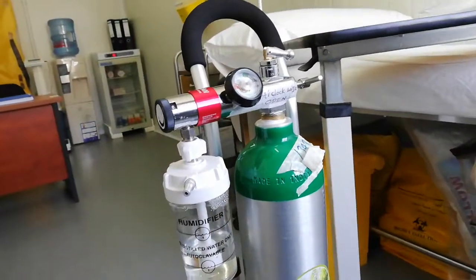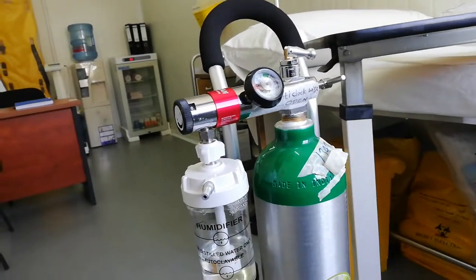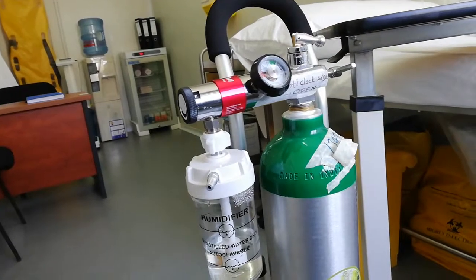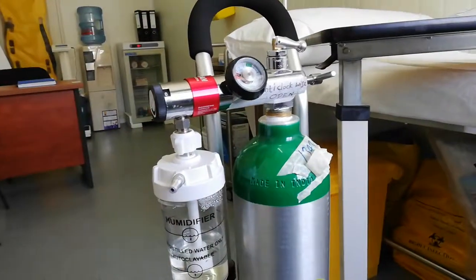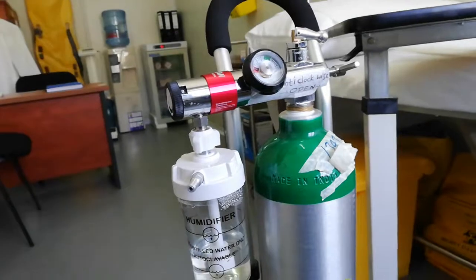Today, I am going to talk about an oxygen cylinder in the medical field. I am going to talk about the oxygen cylinder and mask.